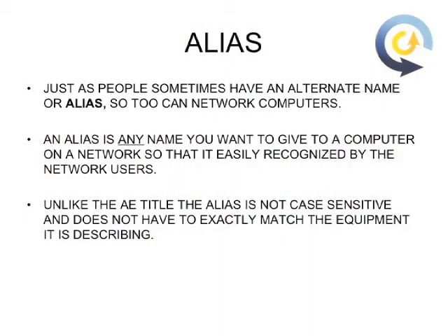Alias. Just as people sometimes have an alternate name or alias, so too can computers on a network. Unlike the AE title, the alias can be any name that you want to designate to the computer or ultrasound machine so that the network users can easily identify it.